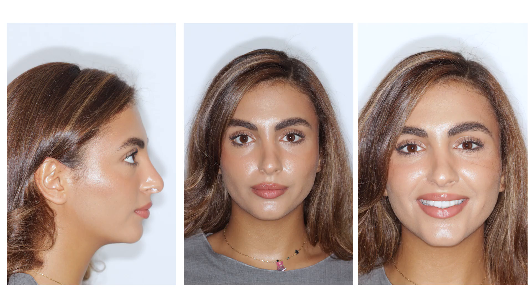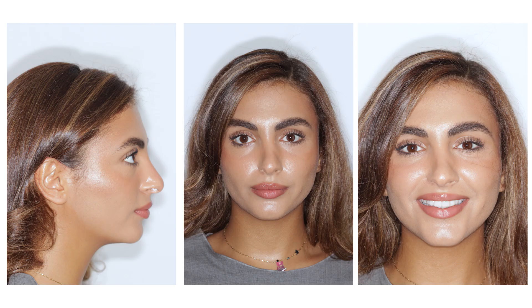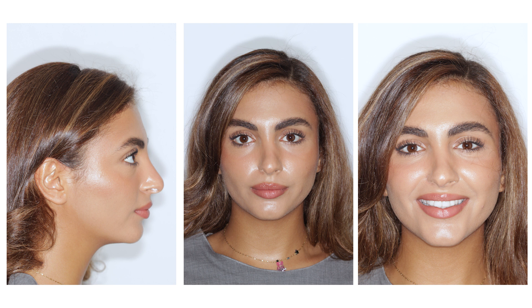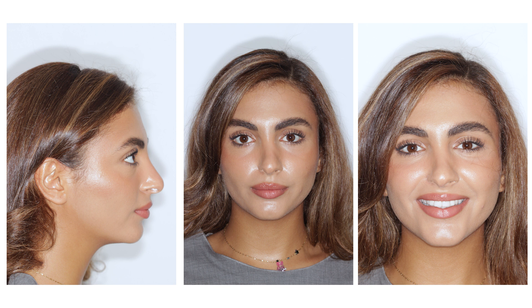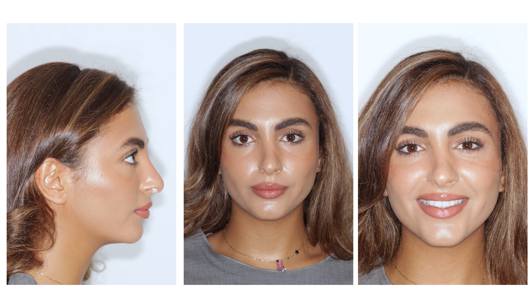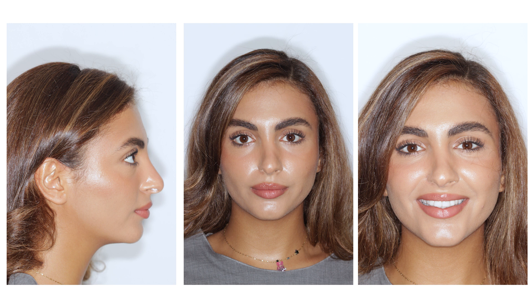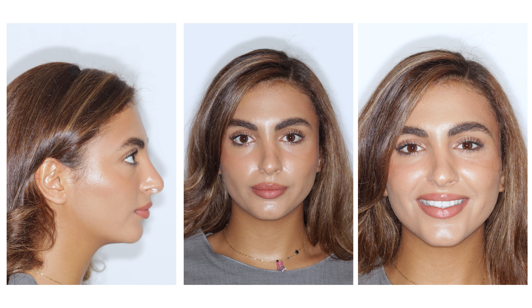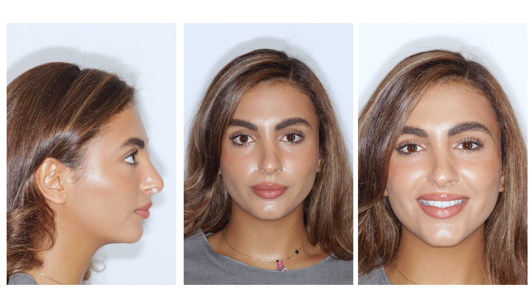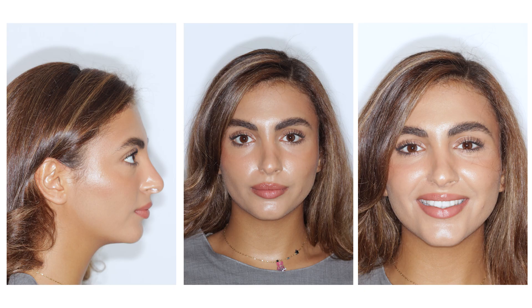Check your photos in your camera, making sure only the patient's face with some background is showing. Too far or too close photos are not recommended and may miss some important details like asymmetries or shifted midlines.